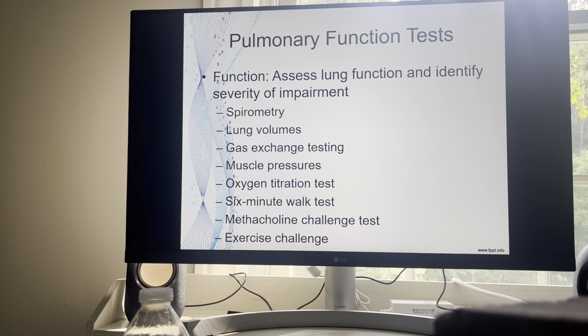And at low doses, the patient will have shorter breath, cough, all that. So it is reversed with albuterol. But this is a useful test for someone who has situational asthma. Let's say the patient just has asthma when they run. Well, when they come into your clinic, odds are they didn't run to your clinic. So they're going to be normal. So the spirometry test can be normal. That's where the methacholine challenge test can come in handy.